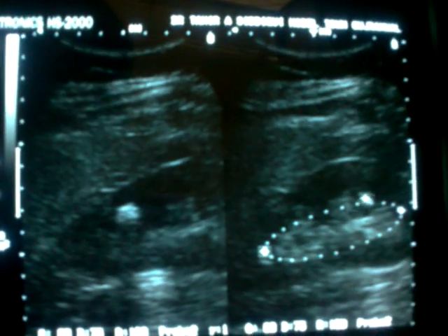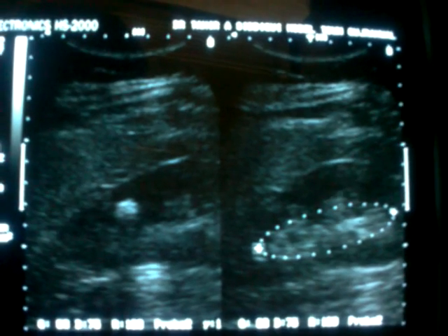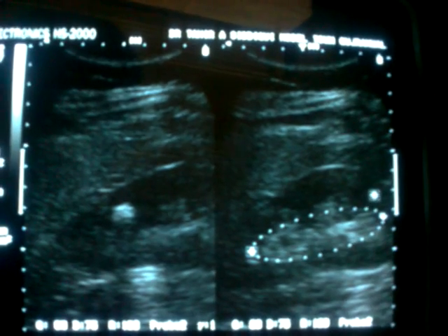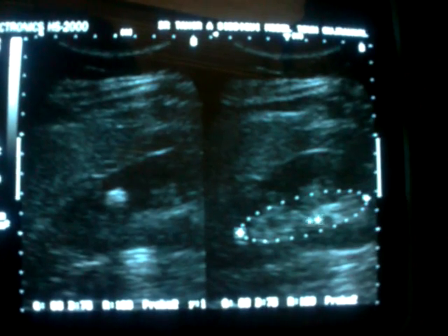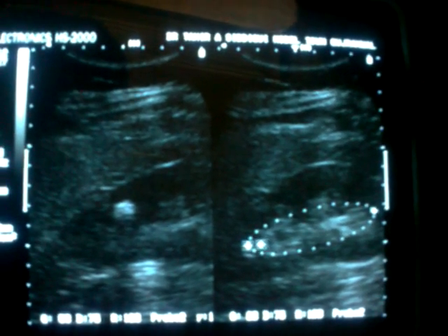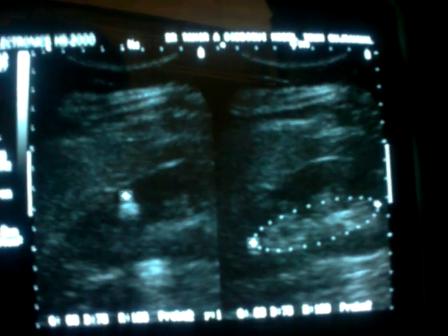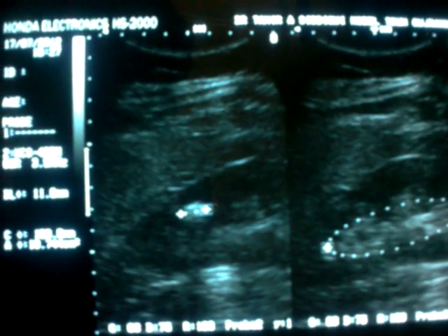The area immediately above the central sinusoidal complex is the medulla — these are the pyramids, this small tiny cystic area. We have normal corticomedullary differentiation, central sinusoidal complex with no calculus and no calcification seen in this region. The calcification seen is in the region of the renal medulla or parenchyma, measuring approximately 11.6 mm, and it produces posterior shadowing.